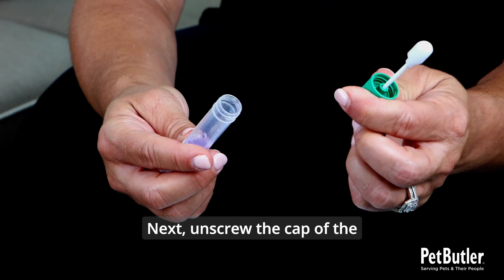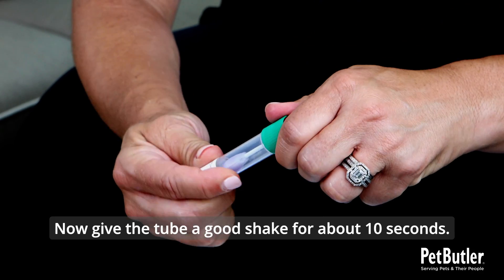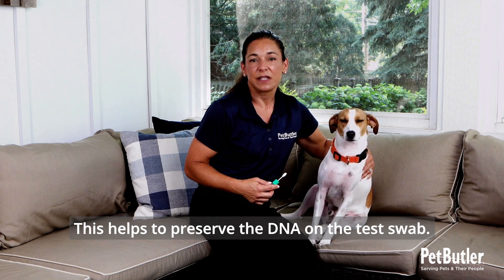Next, unscrew the cap of the tube and place the swab inside. Screw the cap tightly. Now give the tube a good shake for about 10 seconds. This helps to preserve the DNA on the test swab.